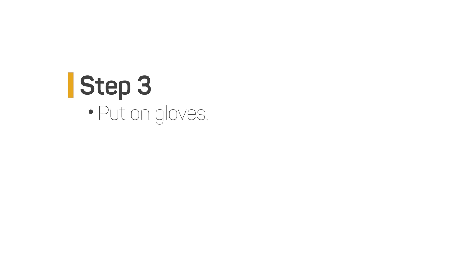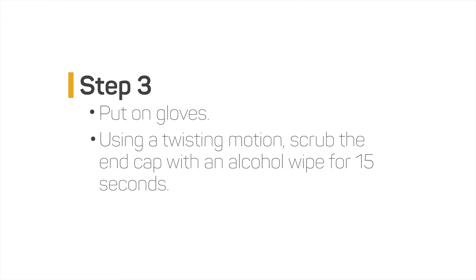Step three: put on gloves. Using a twisting motion scrub the end cap with an alcohol wipe for 15 seconds.